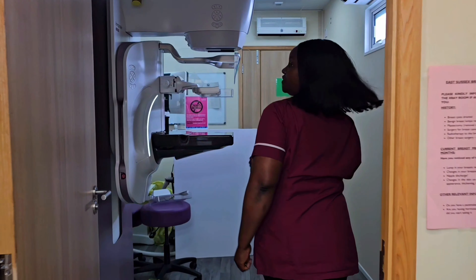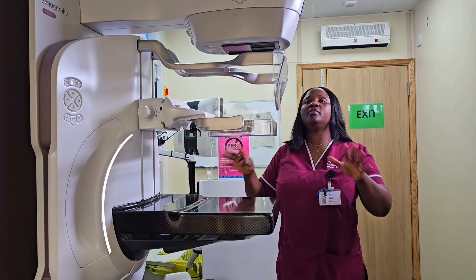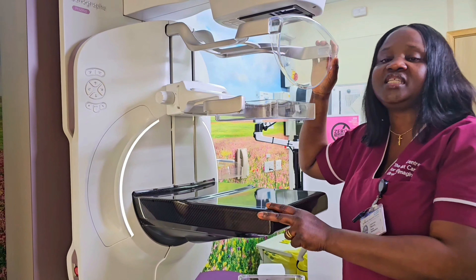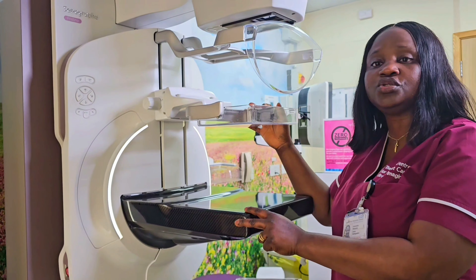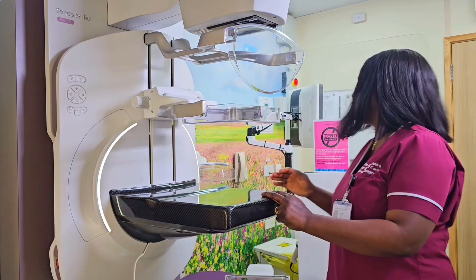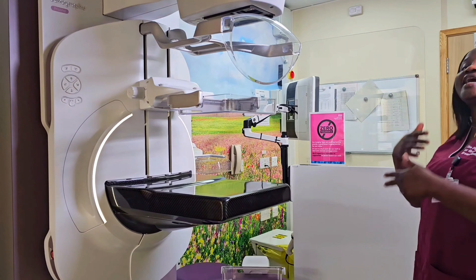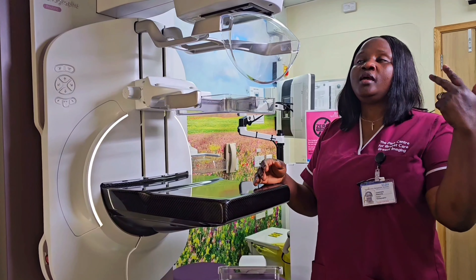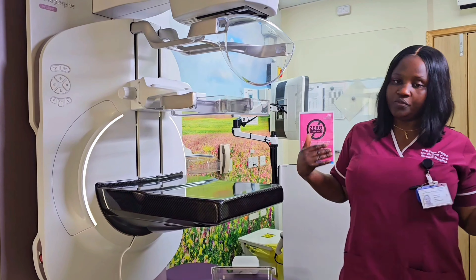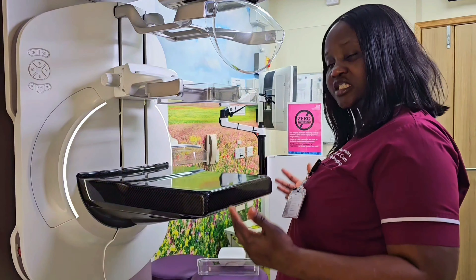When you are called in, this is the real mammogram room — the x-ray room — and this is a mammography machine. When you are invited for breast screening, you are called in here. The mammographer who will be doing the mammogram will ask you again to confirm your details to be sure she is with the right person.